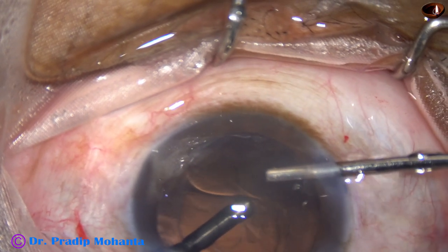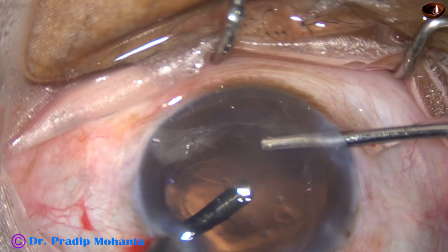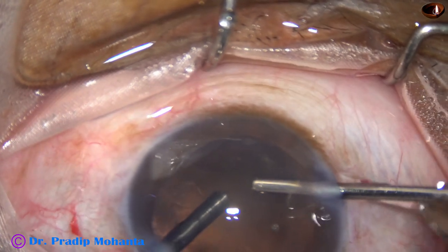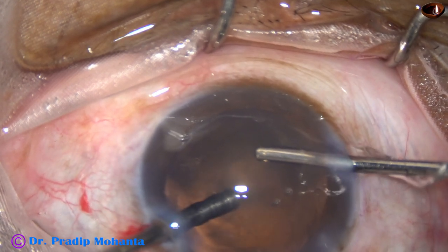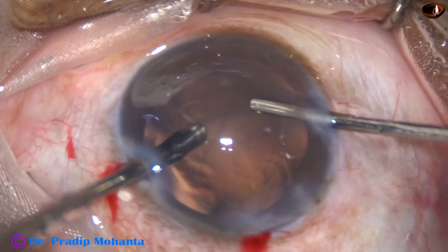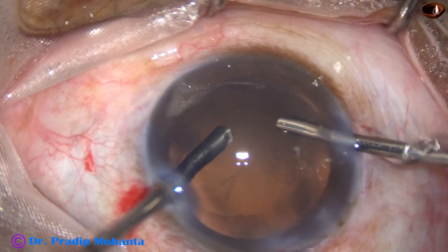I go into the anterior vitreous and do a nice vitrectomy. In this process, whatever Viscoat went into the vitreous cavity is also coming out. A nice, adequate anterior vitrectomy should be done. There should not be any vitreous strand in the anterior chamber — all vitreous strands should go back to the anterior vitreous. The cutter should be functioning well; if the cutter doesn't cut and only aspirates, it is dangerous and can cause a peripheral retinal tear.